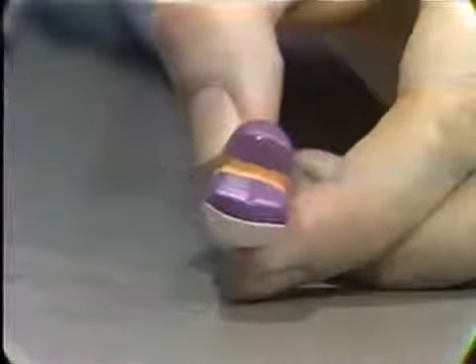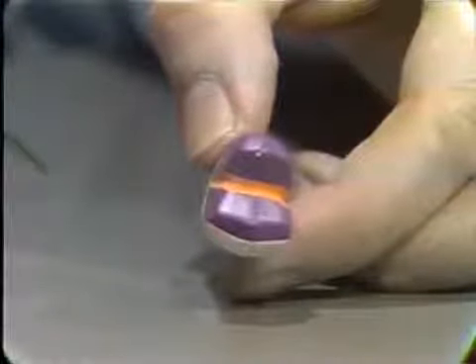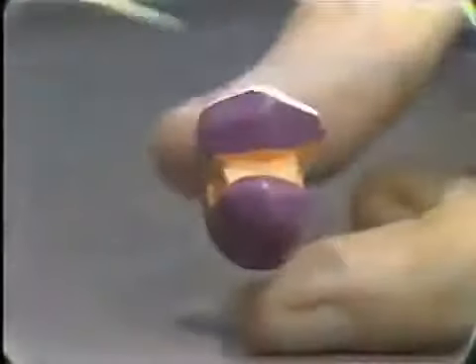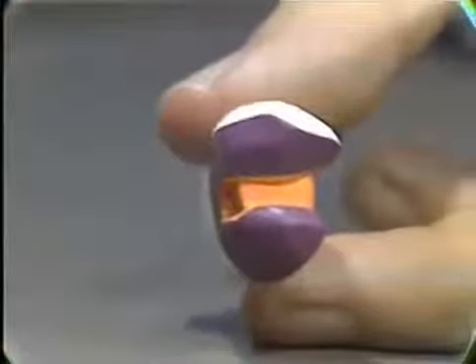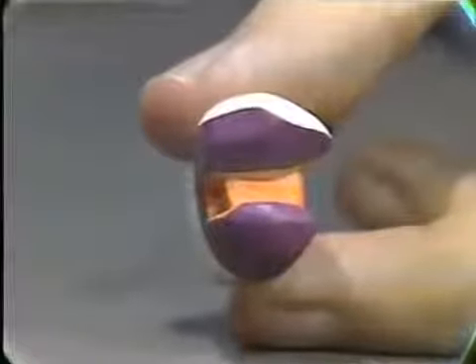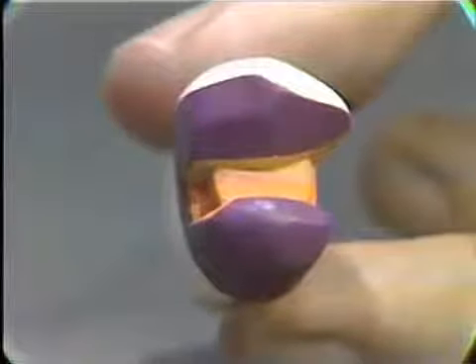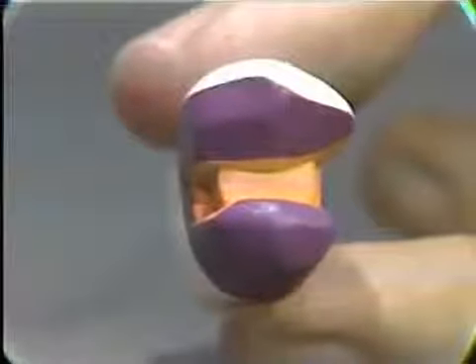It has slices on both the mesial and distal surfaces and is excellent for use on a tooth which has no previous caries or restoration. A somewhat more extensive preparation than that one we were just looking at is one here using the box type of retention and an occlusal keyway running across the occlusal surface, as you see here. You can see that this creates a greater bulk of gold, and gives you a stronger and more rigid restoration. It is one that's typically used perhaps when there's already a previous restoration in the tooth, an MOD amalgam or an inlay maybe, in which this type of box and occlusal keyway has already been cut.